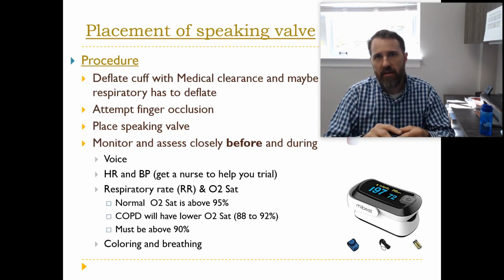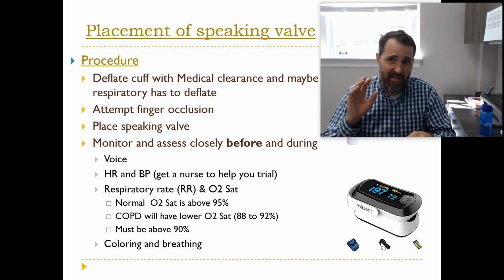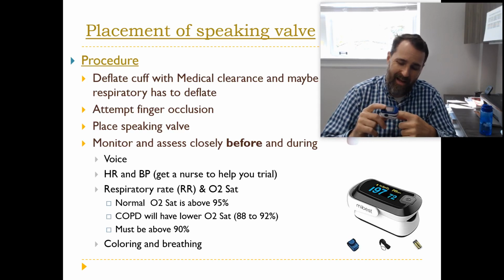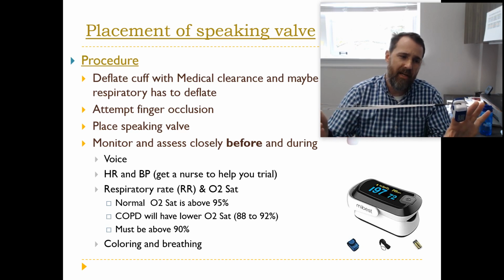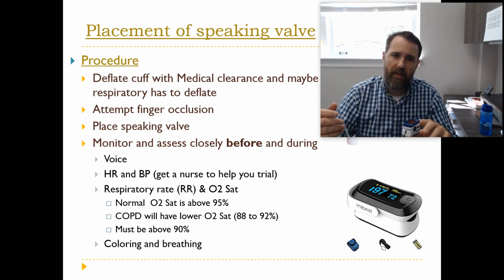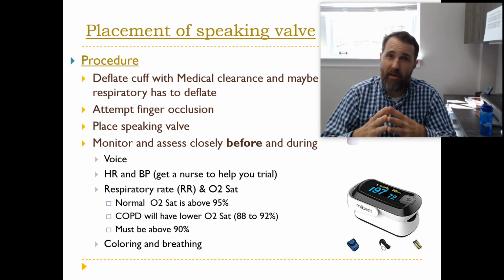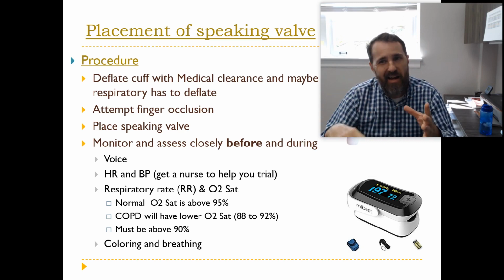As you're trialing the speaking valve, you want to be monitoring their voice to make sure everything sounds normal and you don't hear like their natural airway becoming occluded. As you're doing this, you want to use your pulse ox, have it on the finger of the patient. You want to be monitoring their O2 sat, which is the amount of oxygen in their blood. You want to be monitoring their heartbeat. You want to be monitoring their respiratory rate. And normal O2 saturation is 95 or above.